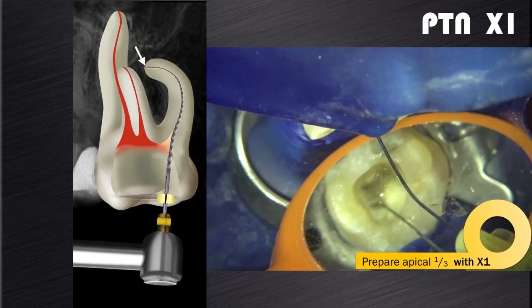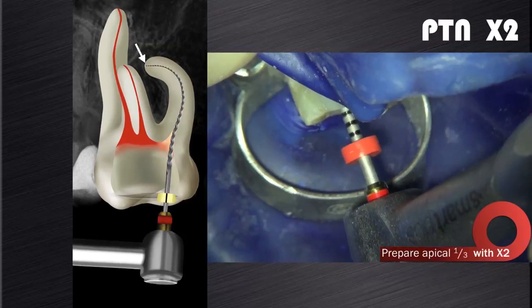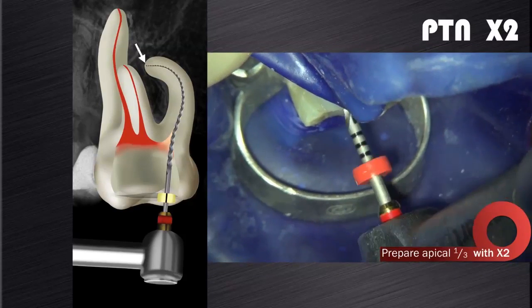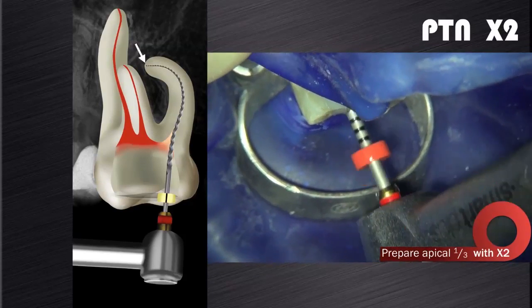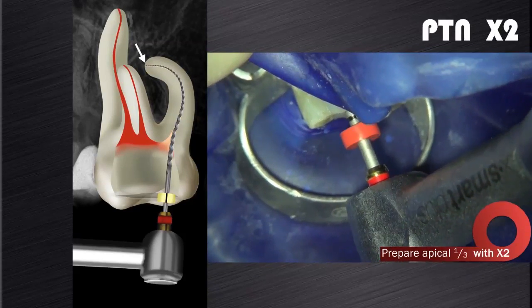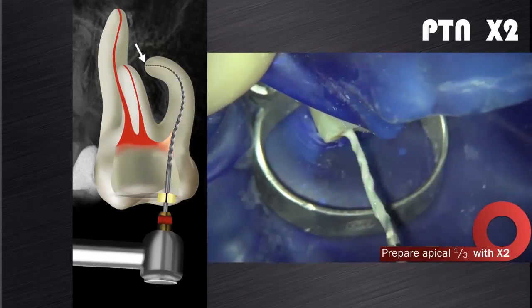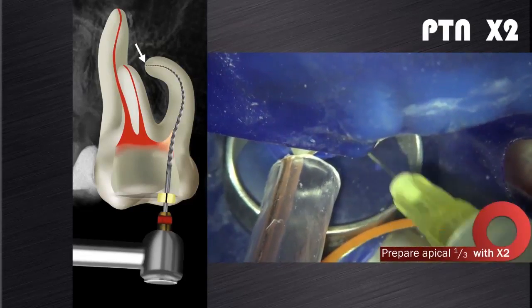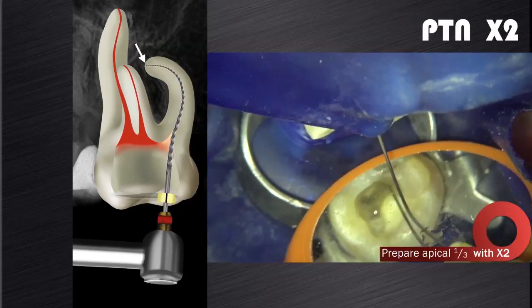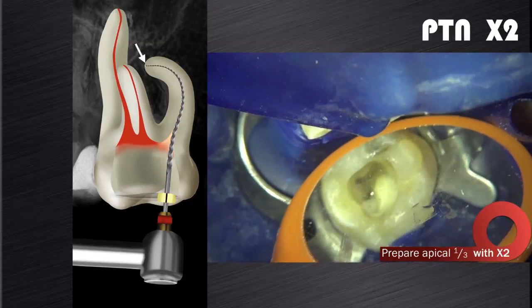This is again followed with an irrigation, recapitulation, and re-irrigation cycle. We can now introduce ProTaper Next X2 again in a conventional way to prepare the apical third of the canal. We irrigate again and verify the canal shape with a size 25 hand K-file as we discussed previously.